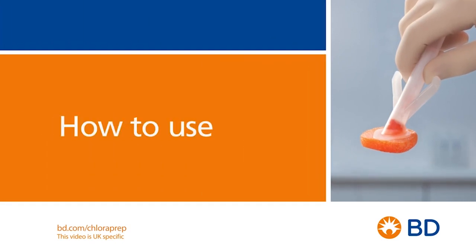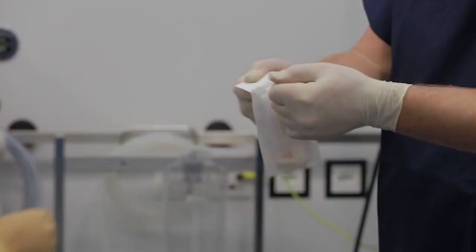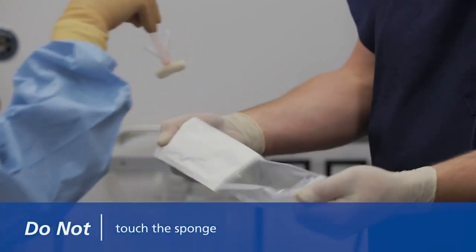The Chloroprep 3ml applicator is easy to use. Simply pinch, apply and dry. To get started, remove the 3ml applicator from its packaging using an appropriate aseptic technique. Do not touch the sponge.